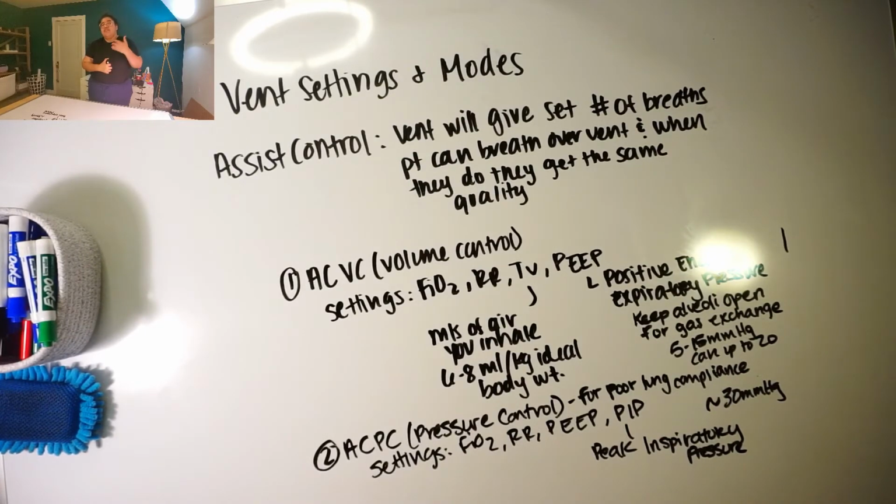Now, if the patient breathes over the vent, say they're at a rate of 12, but they're breathing 16, basically those 4 extra breaths get the same tidal volume, same PEEP, same FiO2.